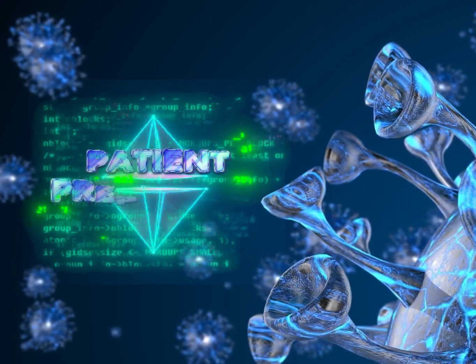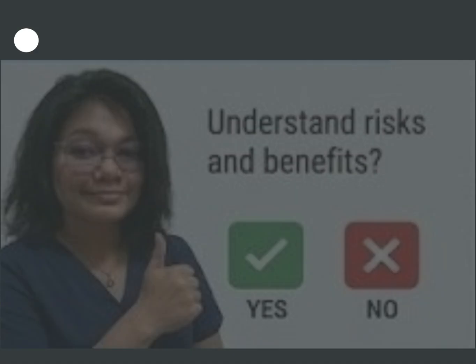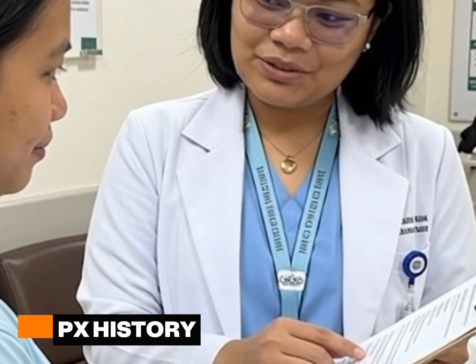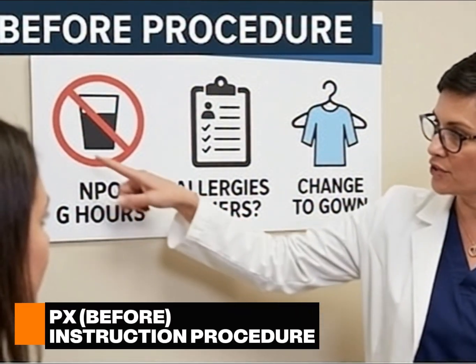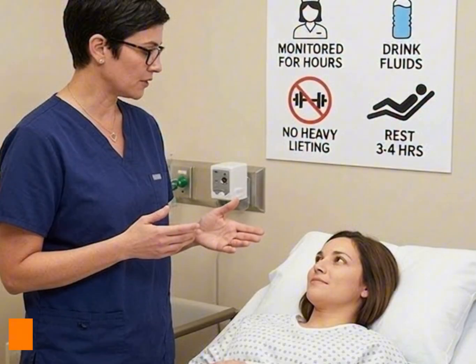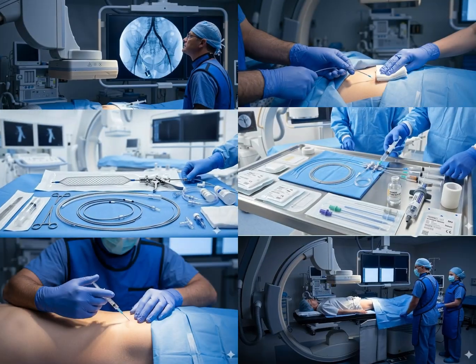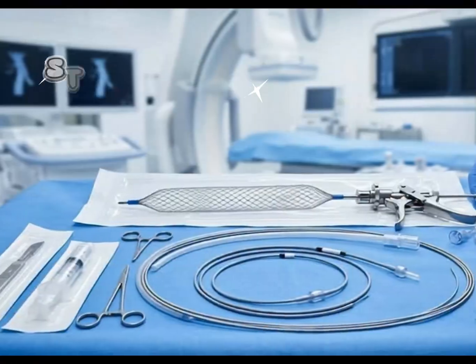For patient preparation, it is very crucial for us to ask the patient for their consent to proceed, take their history, and ask about allergies and whether they're taking blood thinning medication. Before the procedure, patients are instructed not to eat or drink for several hours. Vital signs are checked, and laboratory tests may be reviewed. The patient will be asked to remove jewelry or metallic objects, and after the procedure, the patient will be monitored closely while resting and recovering. And here I will show you the step-by-step procedure.